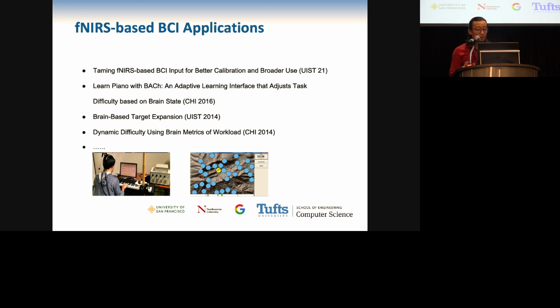In the past 10 years, NIRS-based BCI applications have been explored across very many different scenarios. For example, a piano learning helper. It can detect your mental overload or underload and adjust learning task difficulty levels accordingly.